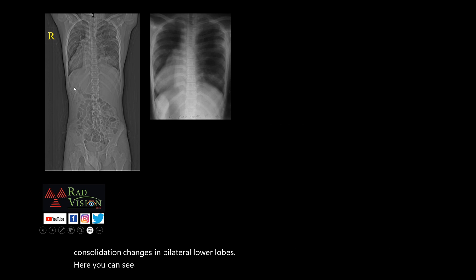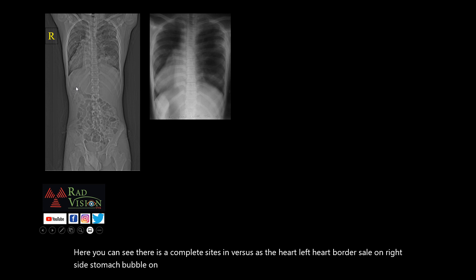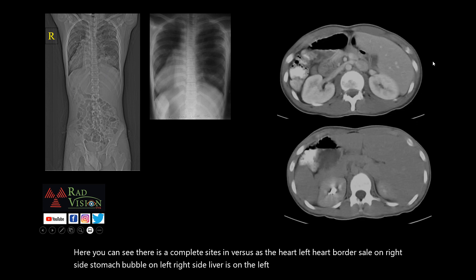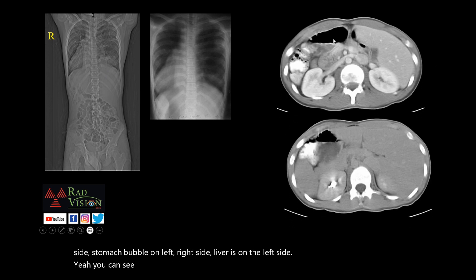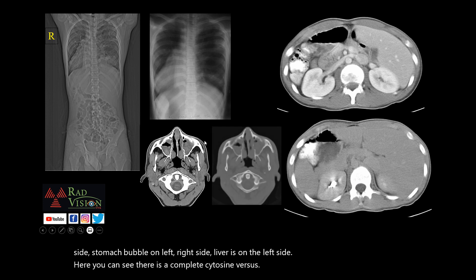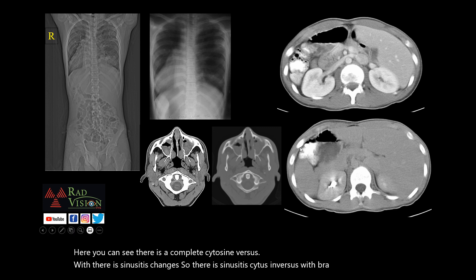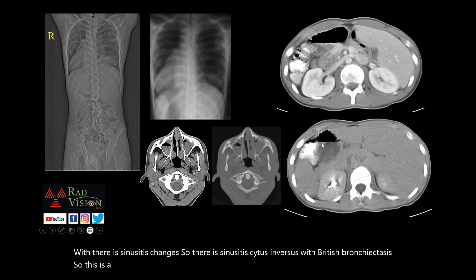Here you can see there is complete situs inversus — the left heart border is seen on the right side, the stomach bubble is on the right side, and the liver is on the left side. There is also complete situs inversus with sinusitis changes. So there is sinusitis, situs inversus with bronchiectasis — this is a classical case of Kartagener syndrome.